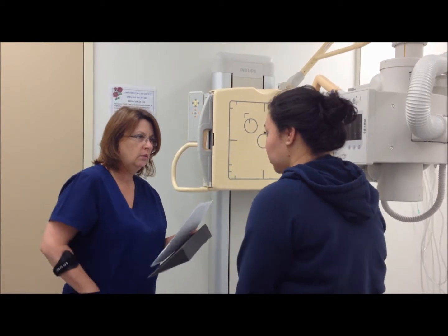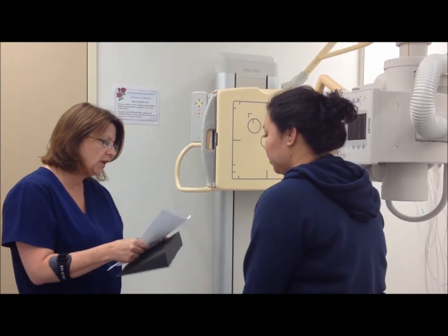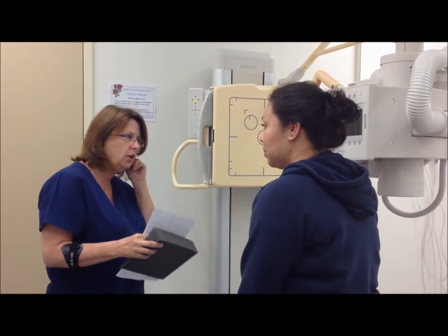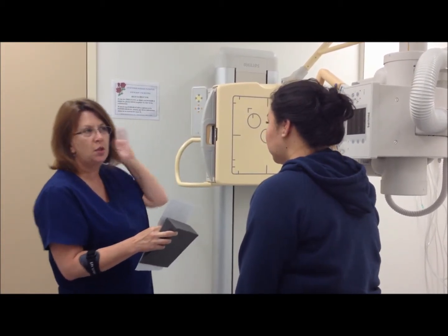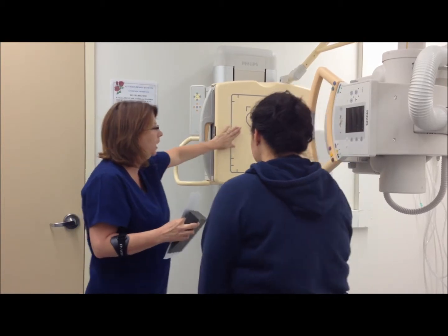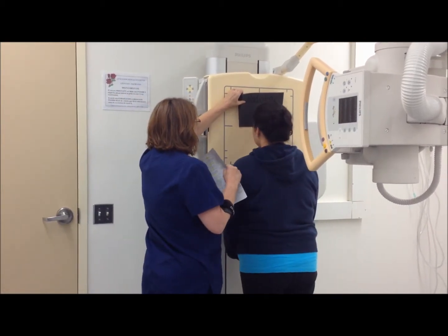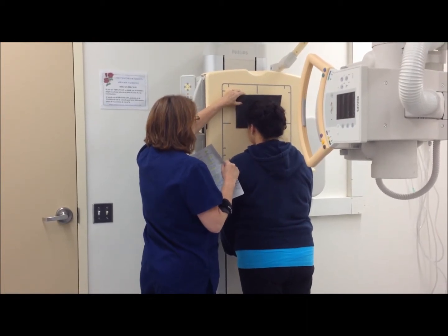Pressure and headaches. Okay, so for the first x-ray we're going to do, any chance you could be pregnant? No. Okay. And you've already taken your earrings out. No clips in your hair? No. Okay, so what I'll have you do is step up to the board here. We're going to use this sponge to pull your forehead off of the board, so just hold and place it.